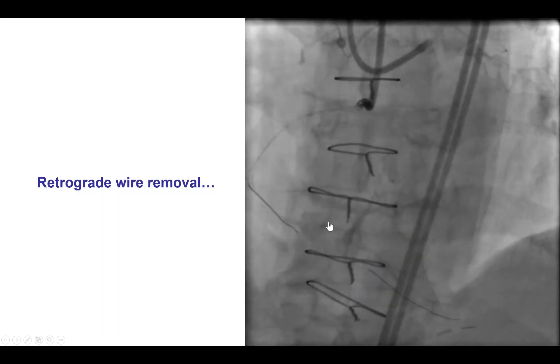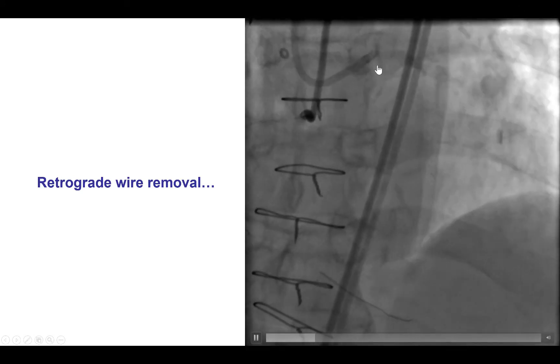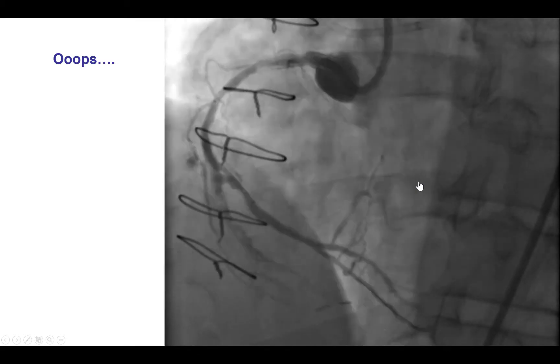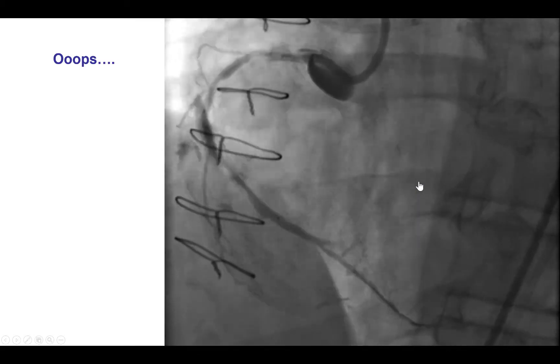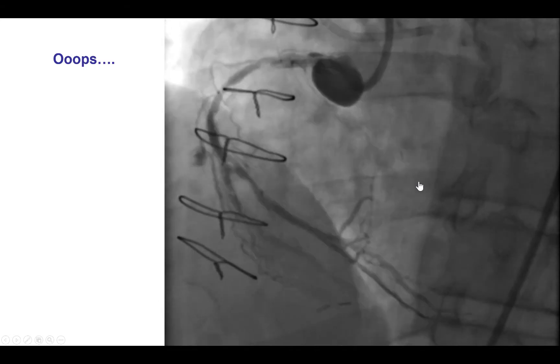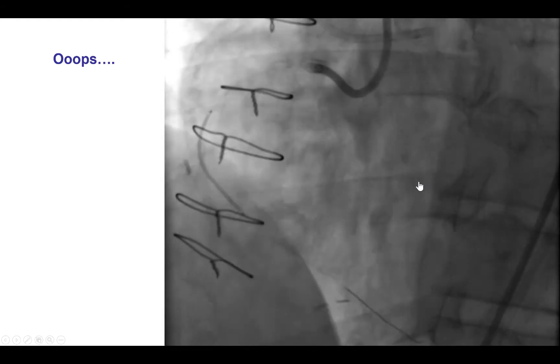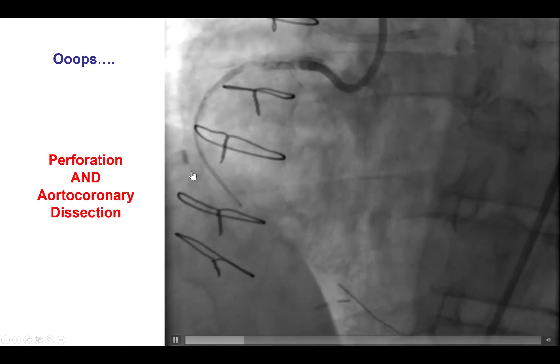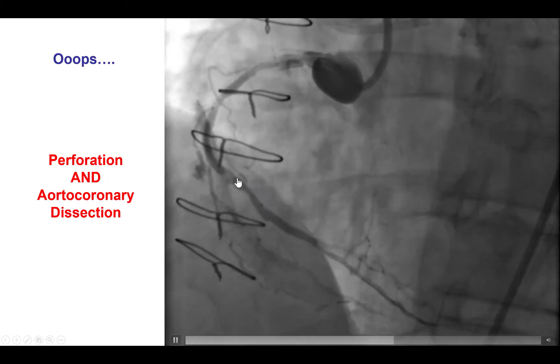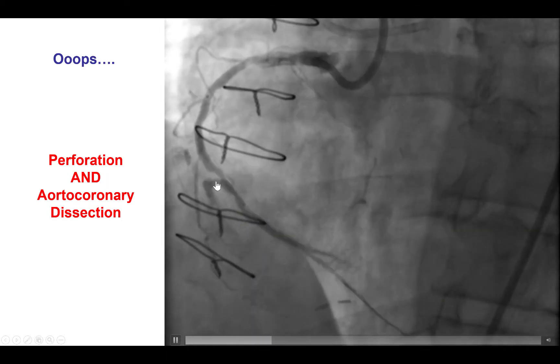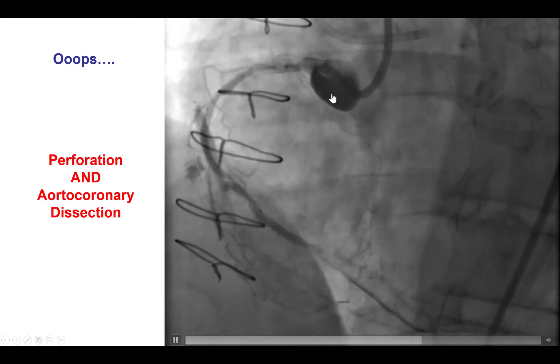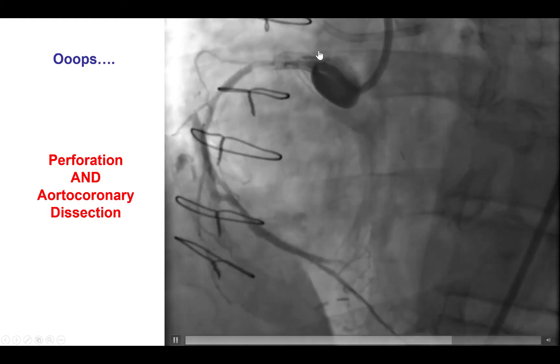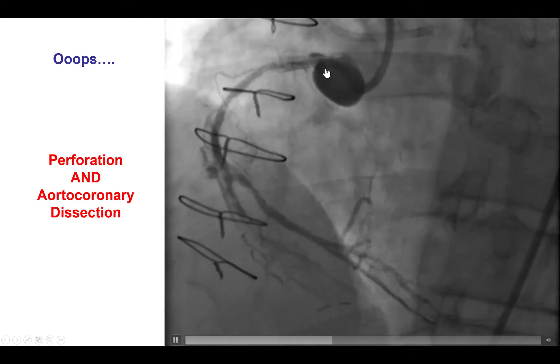We then removed the retrograde guidewire and performed a contralateral injection showing no injury of the collateral vessel. However, when we did an antegrade injection in an attempt to position the stent, two things happened at the same time: we had a perforation into the area of the occlusion, and also a fairly significant aortocoronary dissection. We did have some pressure dampening, and probably the forceful injection resulted in this ostial aortocoronary dissection.